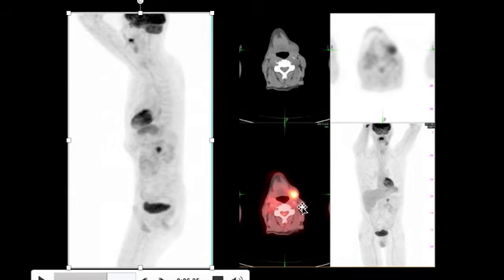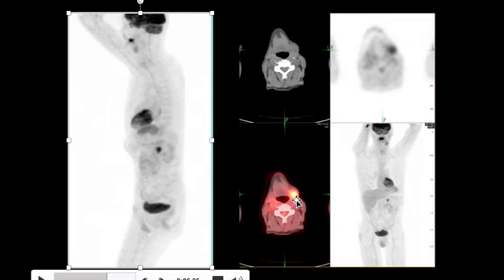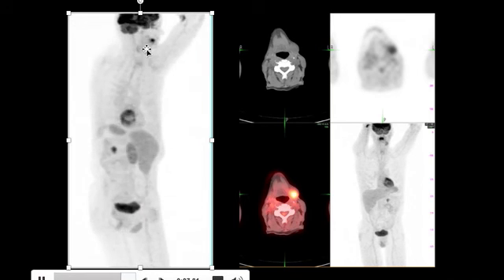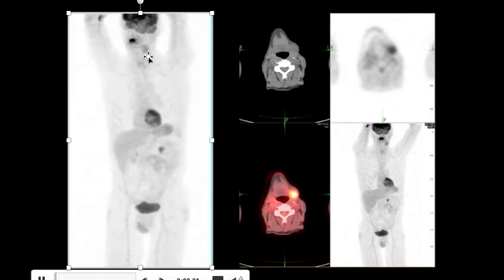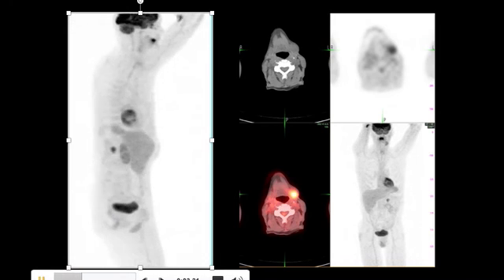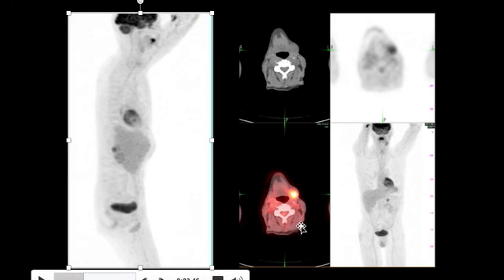This is an example of post-radiation sialadenitis. The teaching point here is that if we were reading this finding only on the fused transaxial image, we can toggle the intensity and make it appear intense and raise the suspicion of recurrent or metastatic cancer involving the submandibular gland. So it's important to review the relative hypermetabolism of any focus of abnormal uptake on the rotating image before we start looking at the transaxial CT, the PET, or the fused PET-CT image.